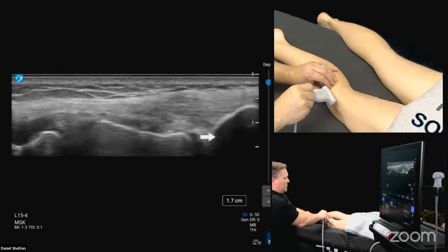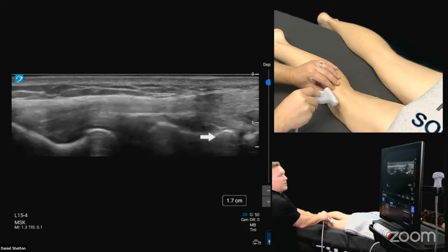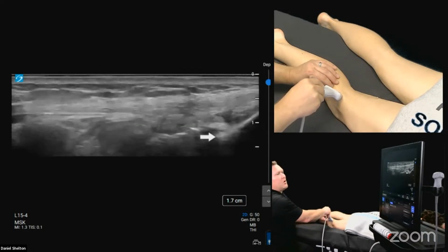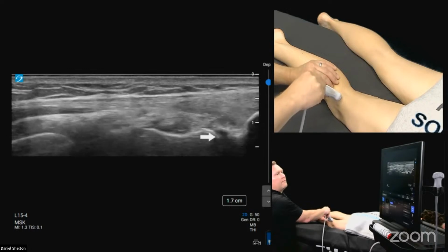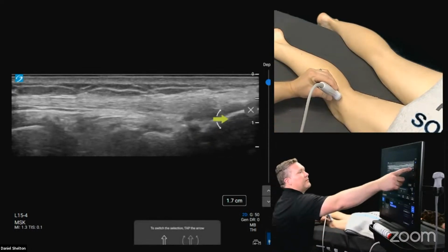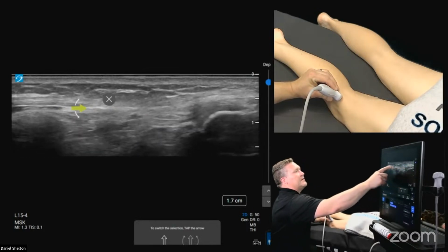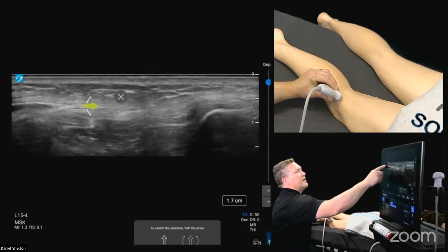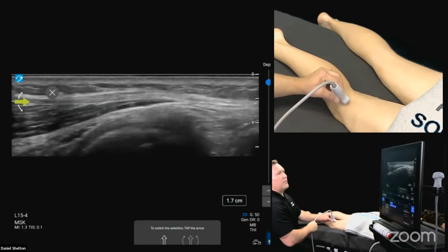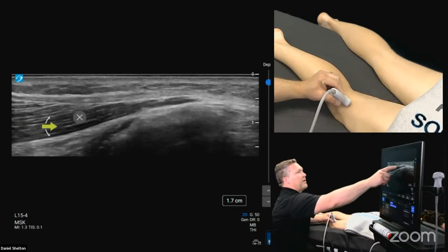So what I'm going to do now, keeping that same pinch on the fibula, I'm going to drag or windshield wiper the probe to the midline, and it's going to elongate a very long tendon superficially. So now we have same fibula. We have fibula here, and then here is the tendon of the biceps femoris. And if I keep climbing proximally, I'll see the muscle belly that we saw in the slides, muscle belly of the biceps femoris here. So this is all muscle belly of biceps femoris.